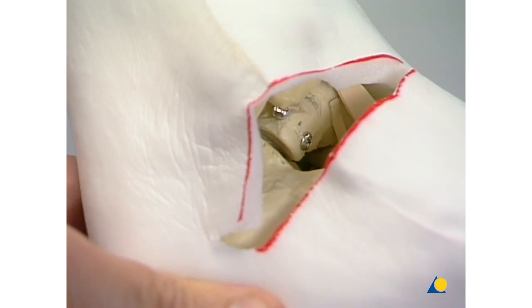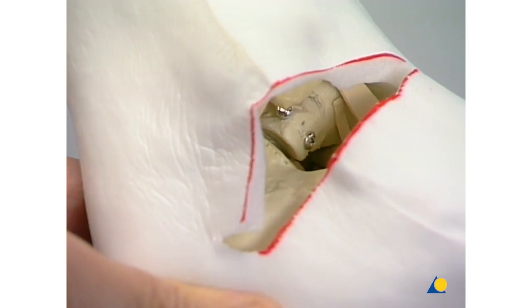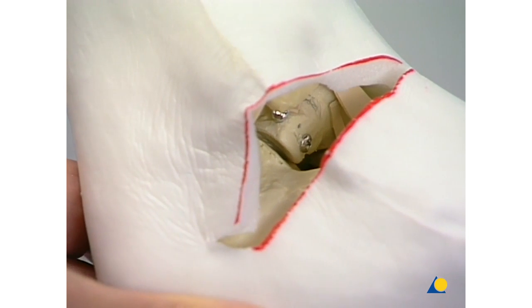After removal of the femoral distractor, the congruency of the subtalar joint can be tested.